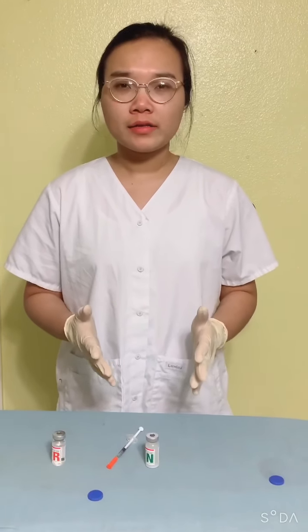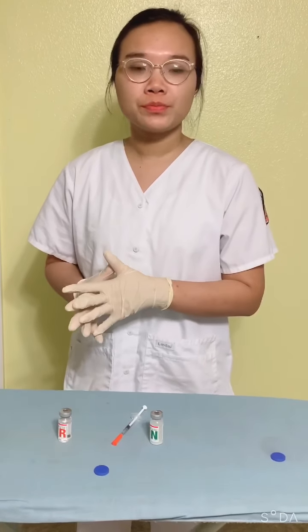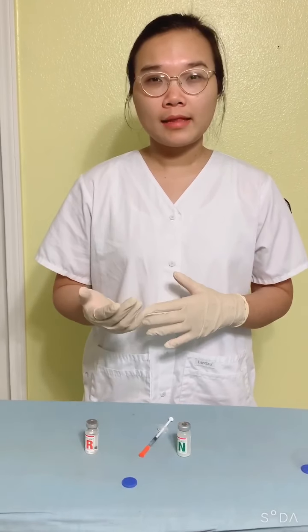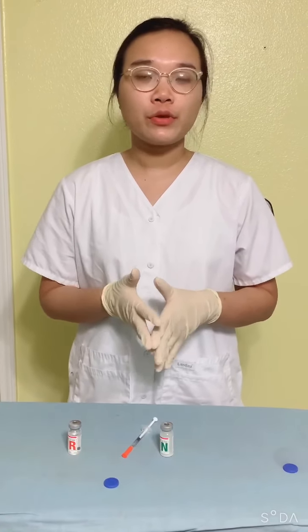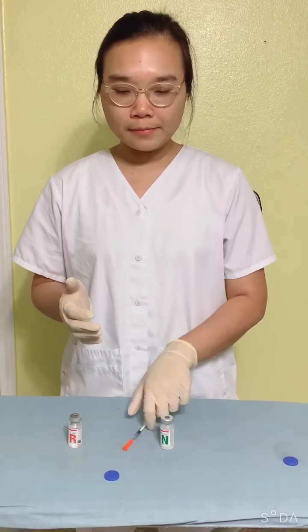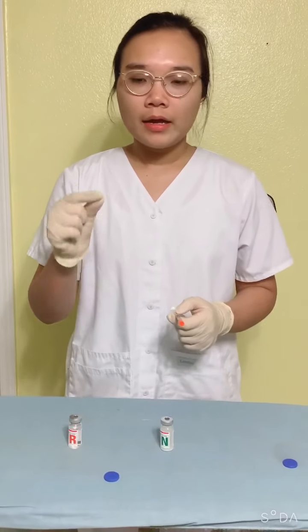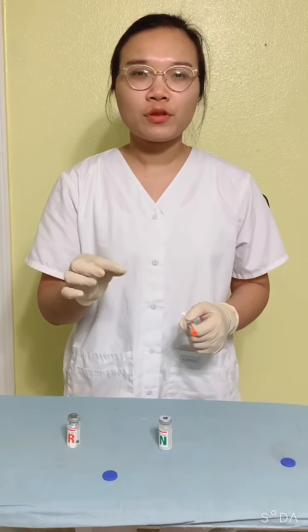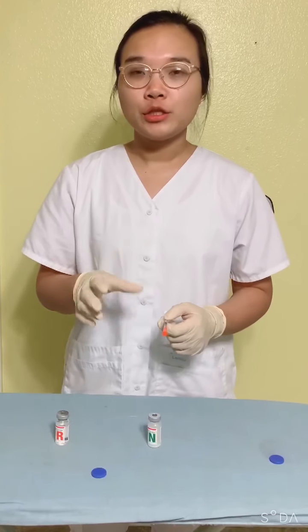After verifying with the second nurse, now I am going to go into the patient's room, and then I would perform a third check. Then I would explain the procedure to the patient. I would clean the site, and then I would pinch the area. If you can pinch 1 inch, you would insert the needle at 45 degrees. But if you can pinch 2 inches, you can insert the needle at 90 degrees.